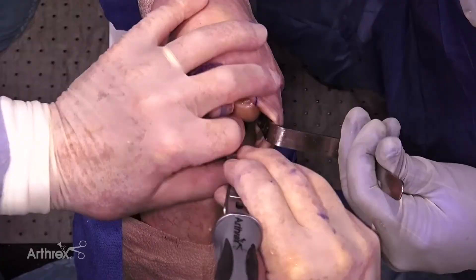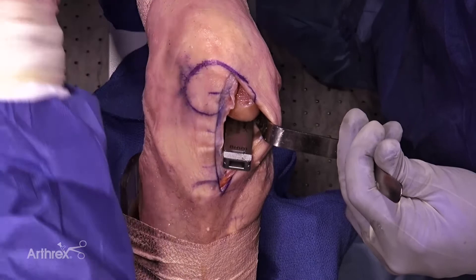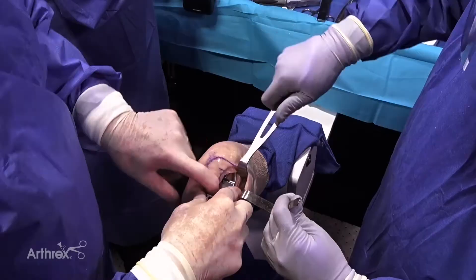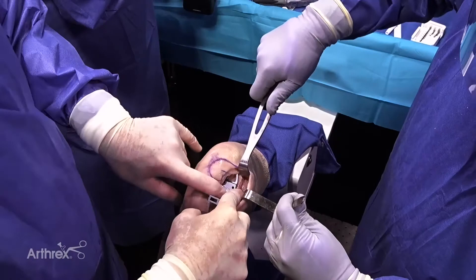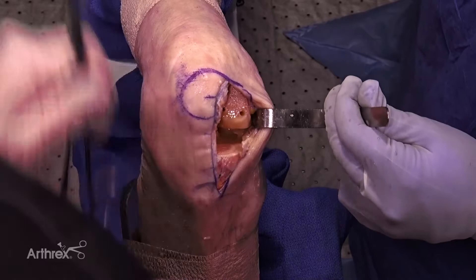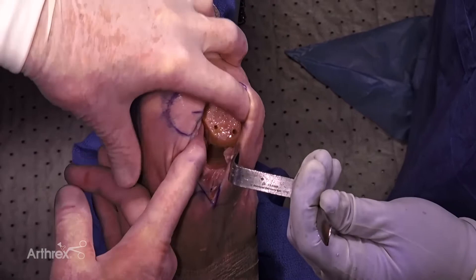Now we're back in flexion. We take our eight back and place that in the flexion space. We are going to take eight millimeters off of the posterior femoral condyle. That slides into place, and it's very important to make sure that we are flush with the cut surface of the femur. We pin that into place. So now we've taken our posterior condyle as well.